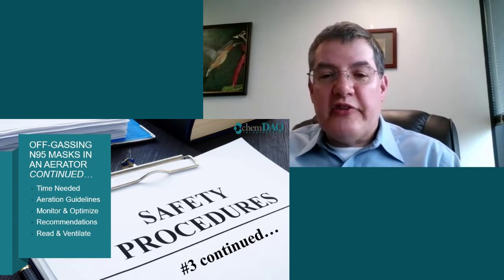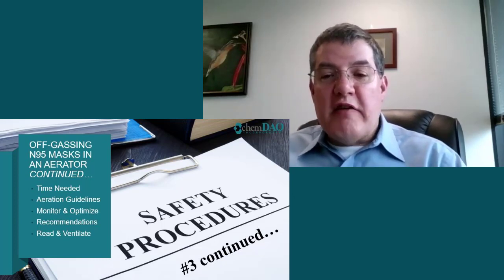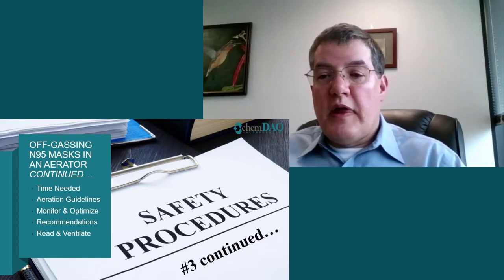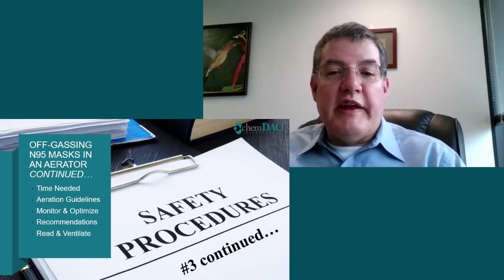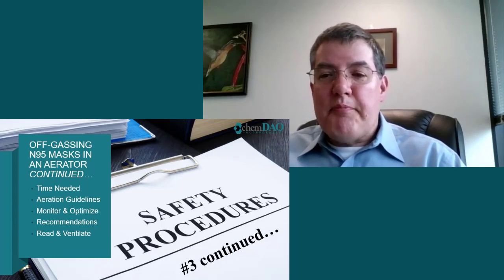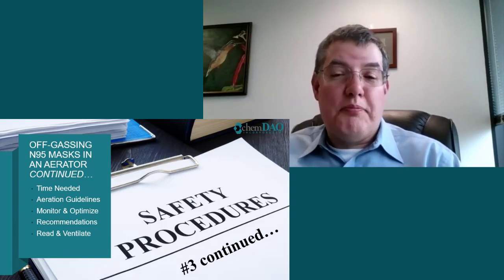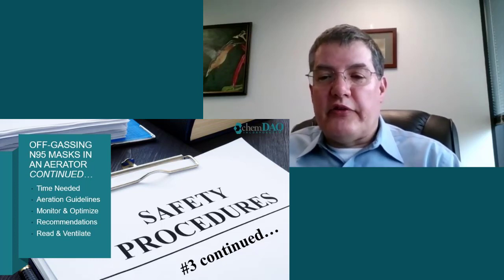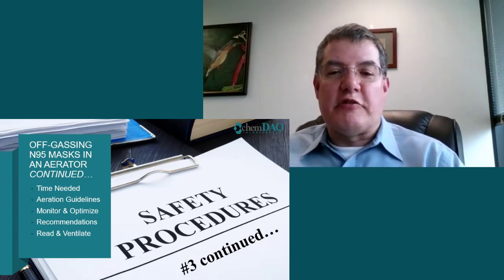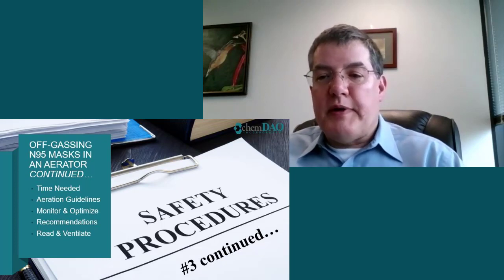OSHA takes this approach because if they were to specify a technology, they risk the regulation becoming obsolete. The OSHA regulations were written in the 1970s, long before the first hydrogen peroxide sterilizer, and back then hydrogen peroxide in air would have been measured using an impinger or a bubbler, followed by chemical analysis. Today we have gas monitors that give a near instantaneous reading that give continuous protection because conditions change, often unexpectedly.